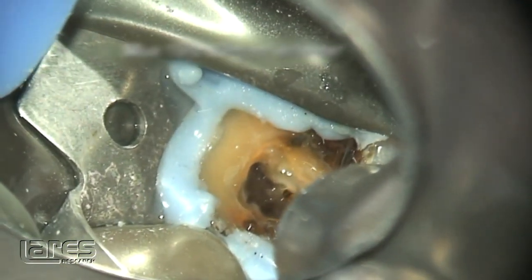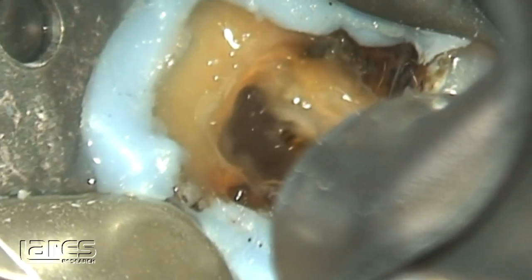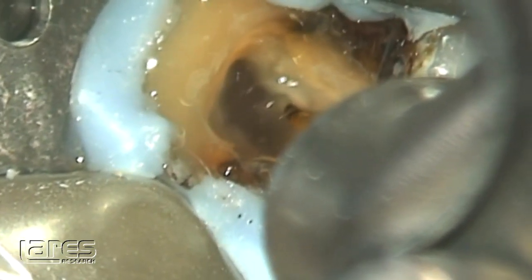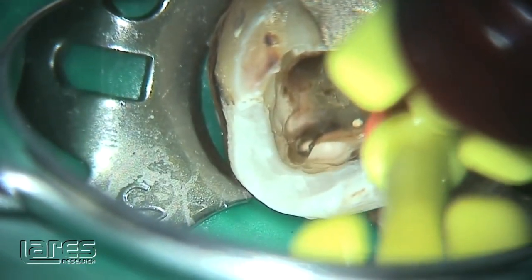When we've done this before on clear teeth, we are in one canal and can see photoacoustic action of the streaming in other canals while we're not even close to those canals. I used to joke with Rico that maybe we're doing root canals on the entire arch if we're doing just one tooth with PIPS, because it's so powerful.